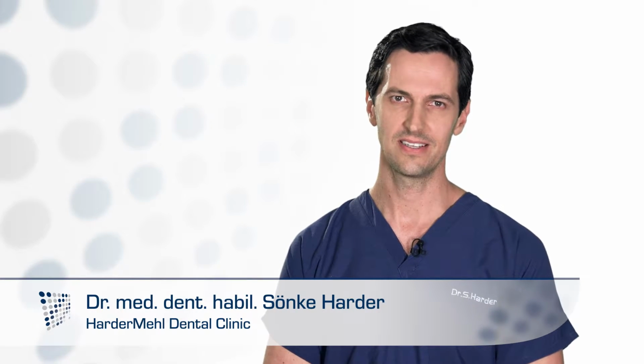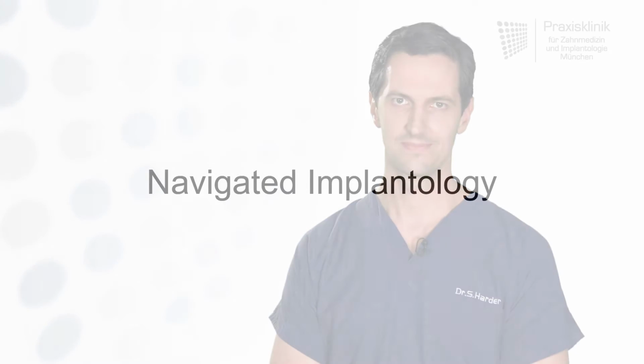My name is Sönke Harder, and in this presentation I'm going to talk about computer-navigated implantology.